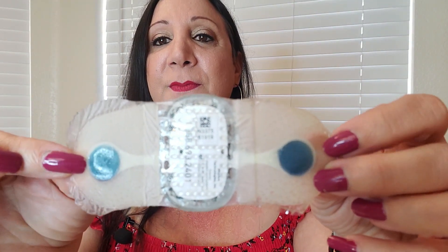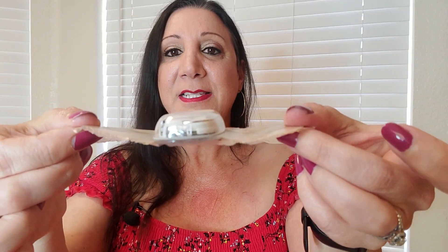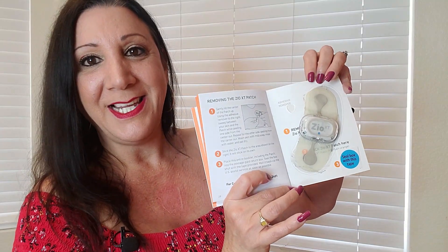Now let me show you what it looks like. This is the Zio patch. Did you notice it started flashing orange? That's because we removed it. This is what the backing looks like, and here it is from the side. Now we're going to put this on the booklet just like they asked — it sticks on very easily. Then we seal the box up with the tape and mail it in using the United States Postal Service.